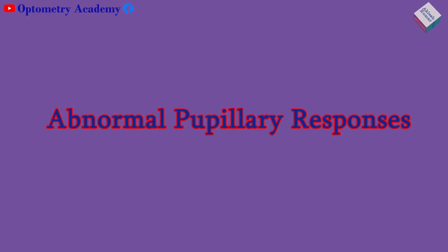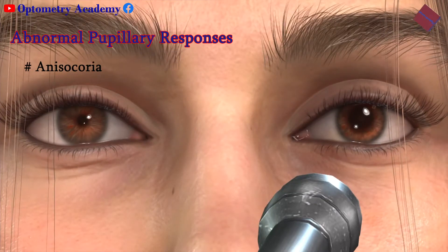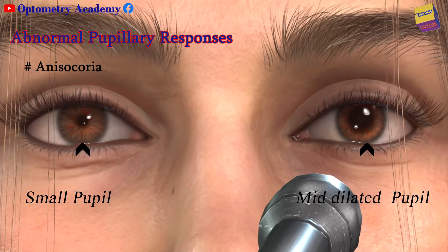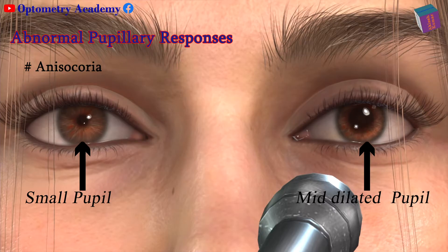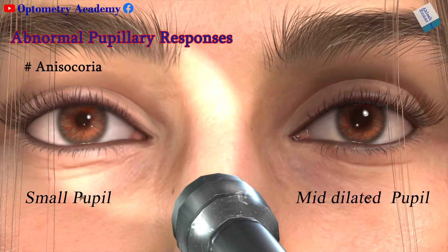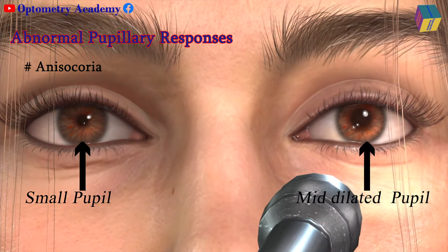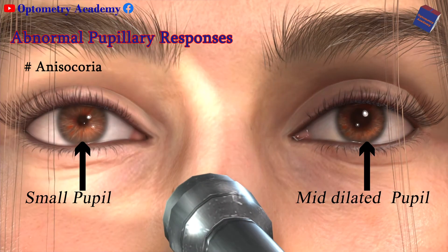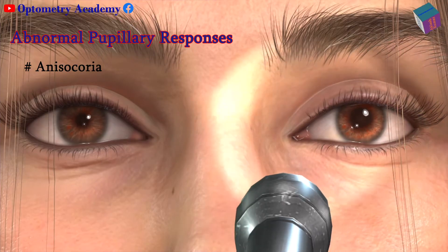Abnormal Pupillary Responses — Anisochoria refers to the asymmetric size of the pupils. Physiologic anisochoria is very common and a normal variant in up to 20% of the population. The variation should not be more than 1 mm and both eyes should react to light normally.